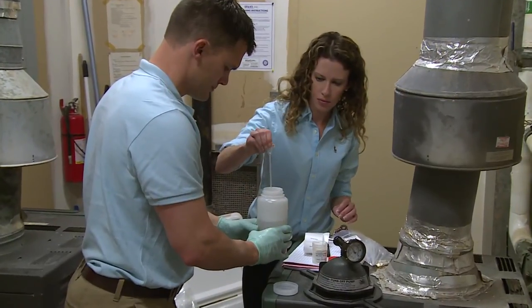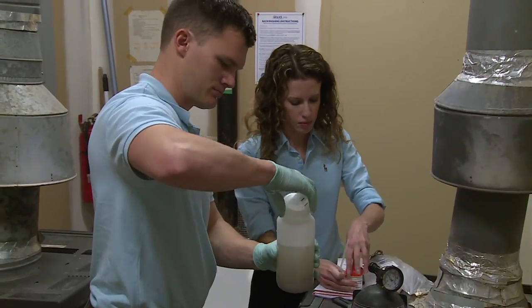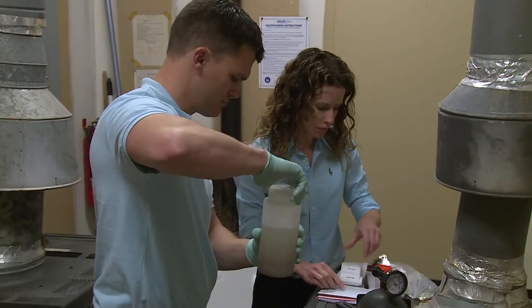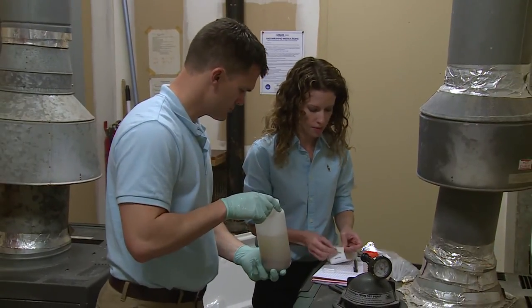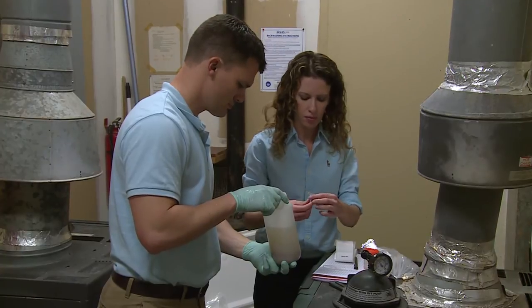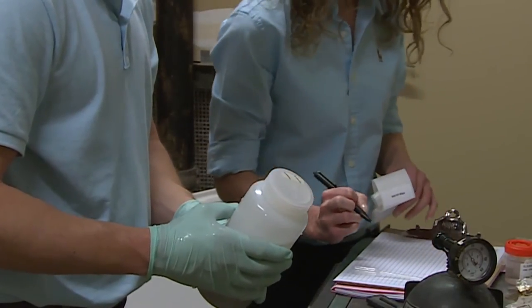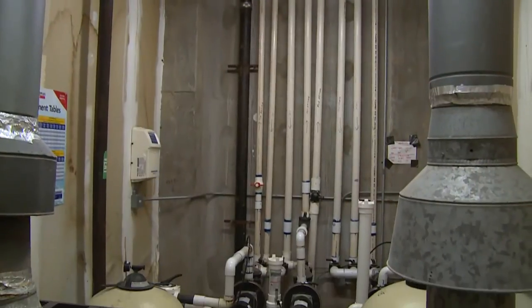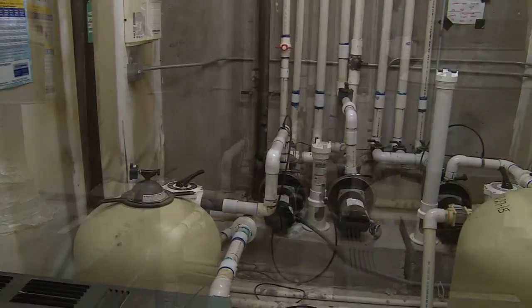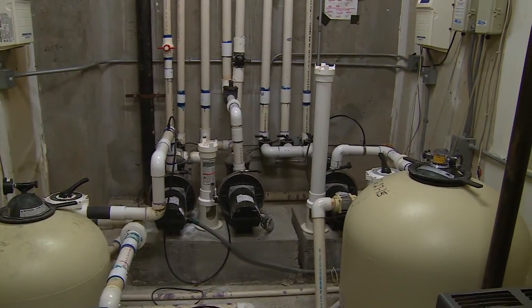With each filter sample you take, add 0.5 milliliters of 0.1 normal sodium thiosulfate solution to the sample to neutralize residual disinfectants. Tighten the top to prevent leakage. Label each bottle with a unique identifier, record the type and location of each sample on the sample datasheet, and place it into the cooler. Note that collecting filter samples may disrupt the integrity of the filter, requiring maintenance service or replacement.